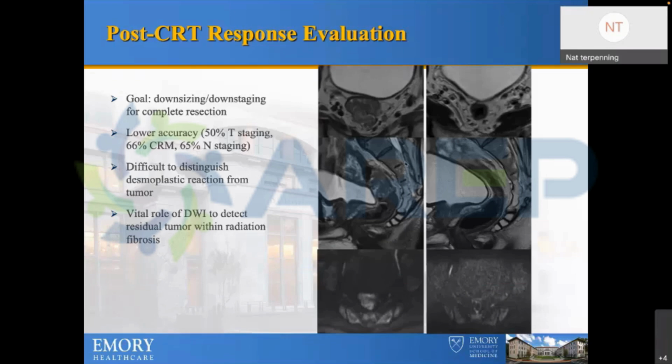That's a good question. So when the patient lies on the scanner, they do the scout view. Scout views are usually T2 HASTE or SSFP or something like that. It's just very quick. They see the rectum. The first thing the technologist does is sagittal. Sagittal is always the same; we don't change the sagittal. So the first thing they acquire is a sagittal plane, and then they send this to PACS.